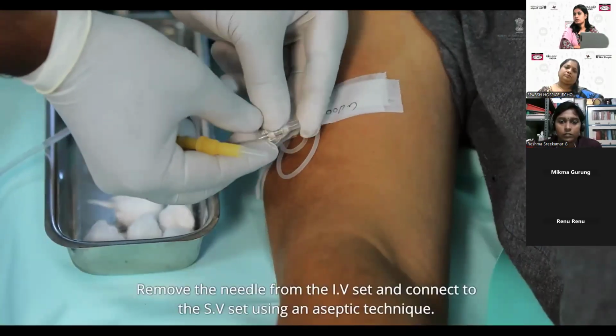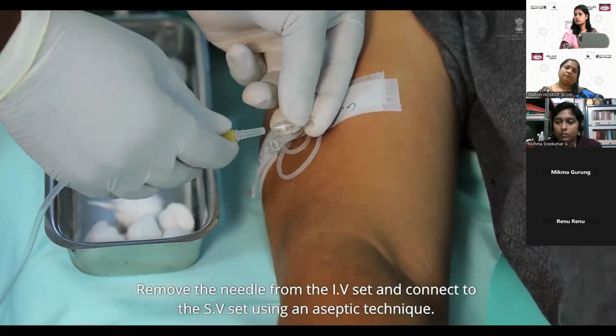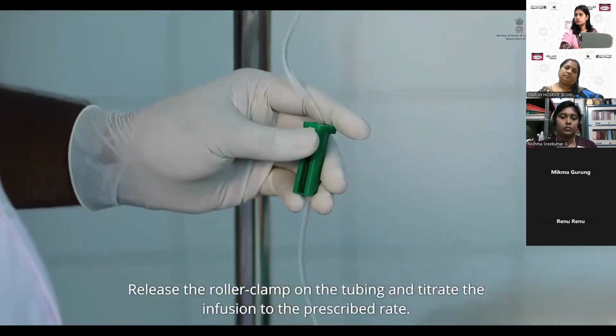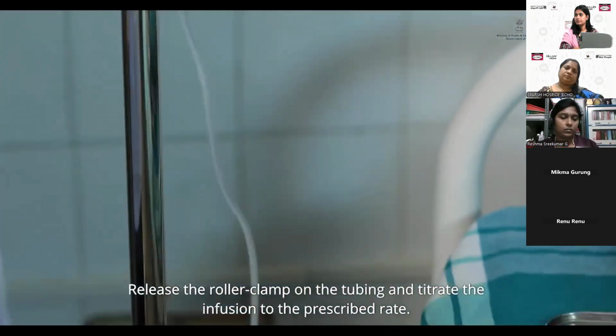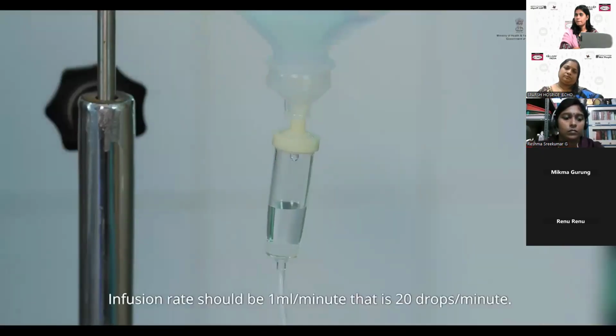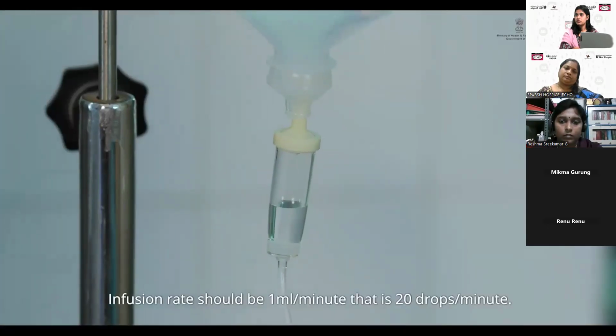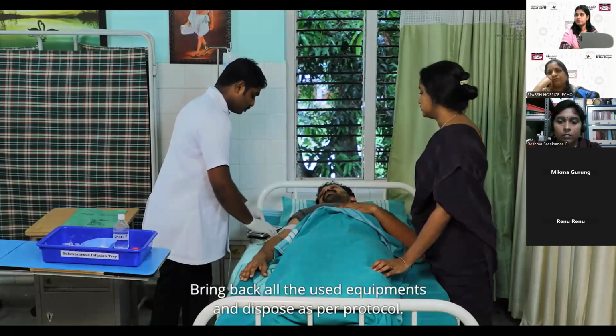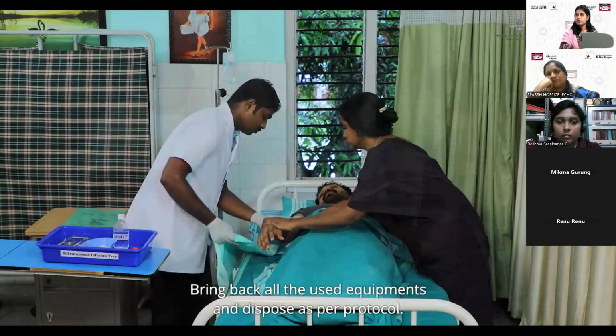Remove the needle from the IV set and connect to the SV set using an aseptic technique. Release the roller clamp on the tubing and titrate the infusion to the prescribed rate. Infusion rate should be 1 ml per minute, that is 20 drops per minute. Bring back all the used equipments and dispose as per protocol.